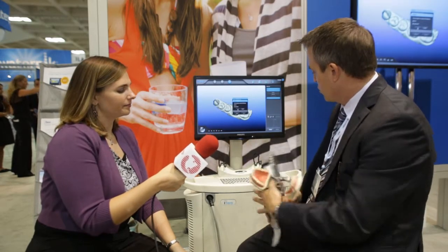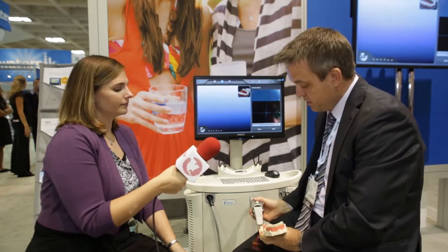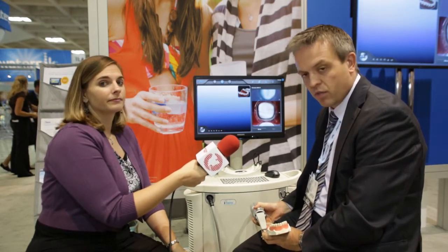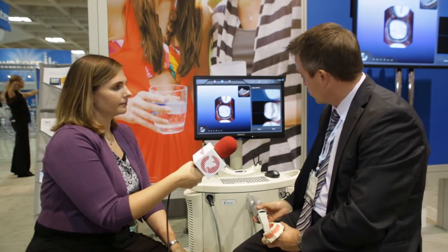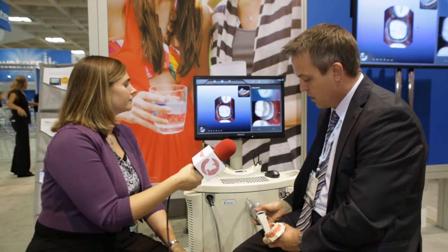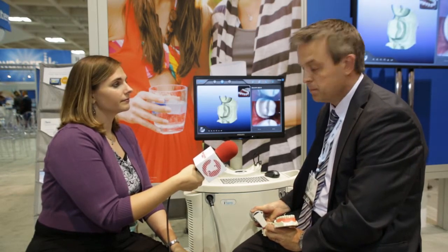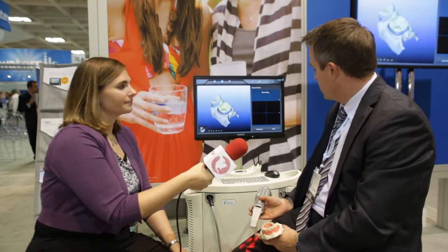Can you show us how it works? I'd love to. So I will show you a quick little demo here. I'm going to scan the preparation — tooth number 19. I'm actually contact scanning, so I'm resting the scanner on the tooth that I'm scanning. I'm not powder coating the teeth with anything. These are raw data scans. And as I'm scanning, I'm building an image on the screen — I'm getting it in real time. There's also a voice prompt that walks me through the whole sequence, so I know exactly where to scan as it builds the image.